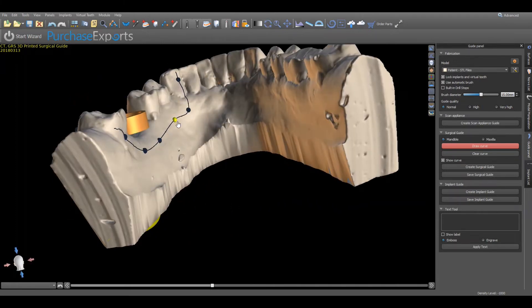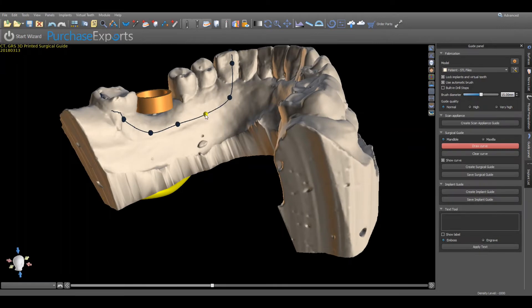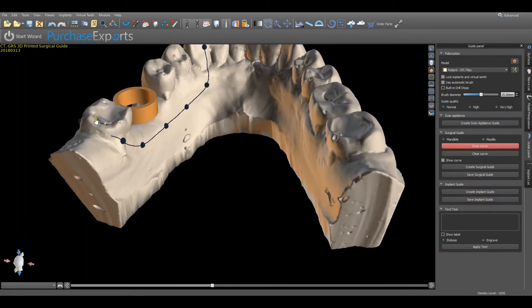If an entirely new design is required, click on Clear Curve under the surgical guide submenu.